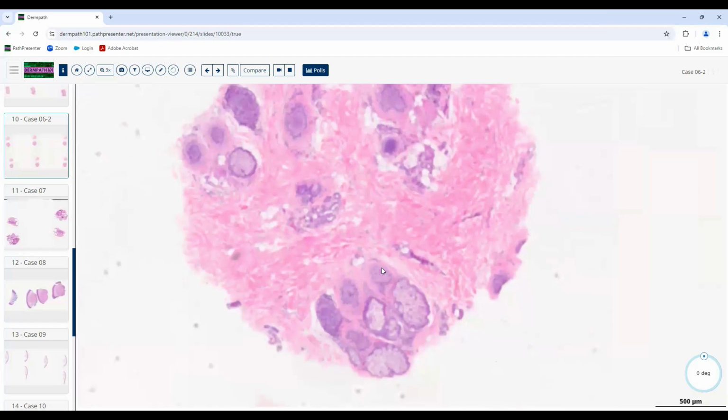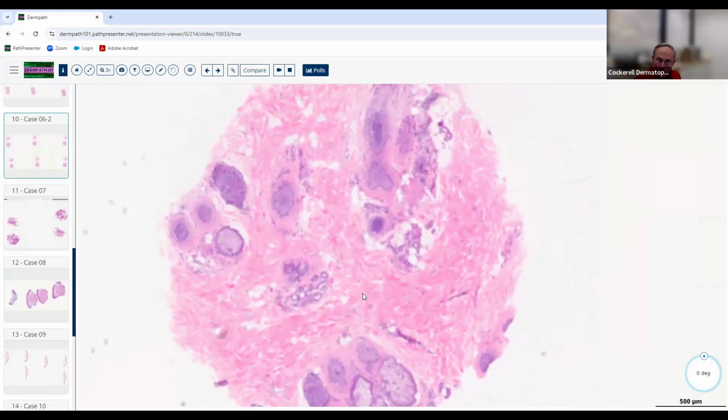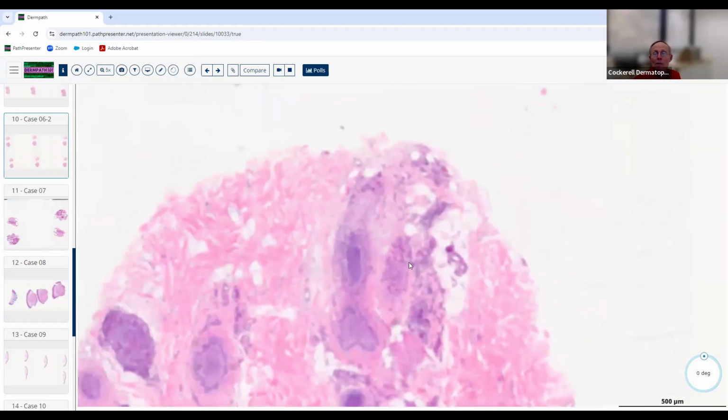There's a couple of things. One is they're in telogen phase. Good, good. All of them are in the same stage of involution. In fact, I think they're actually catagen and telogen. These things were sitting there normally growing, everything's fine, and suddenly, boom, something caused them to shift all at once into a catagen and telogen phase. And what else did you notice about this?